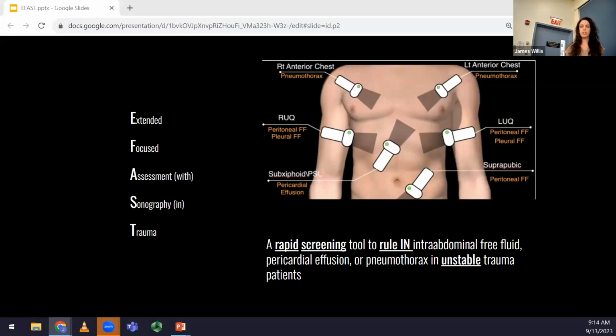Just think critically in these scenarios. If you have a patient with a deep penetrating abdominal stab wound that penetrates through the musculature, that patient most likely has intra-abdominal injury. And again, even if you have a negative FAST in that scenario, probably not going to preclude them from getting additional images, probably going to the OR. So just be thinking critically about how you're using it.